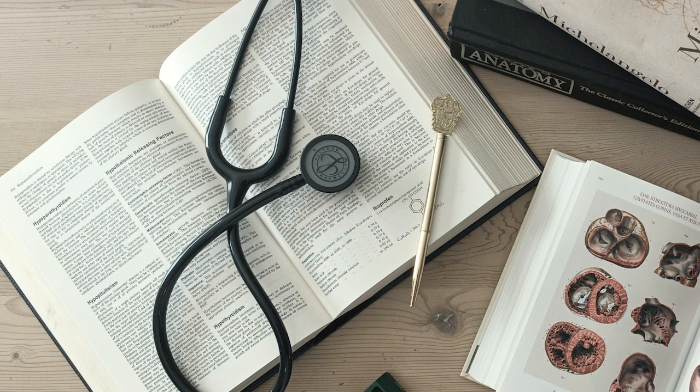That's the key. It signifies that atrial depolarization is simply not occurring, or not being consistently initiated by the SA node. Your immediate question should be, if there are no P waves, how are QRS complexes and T waves being generated? Right, where's the beat coming from?